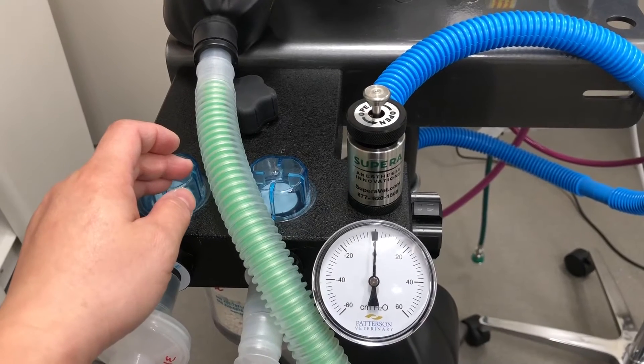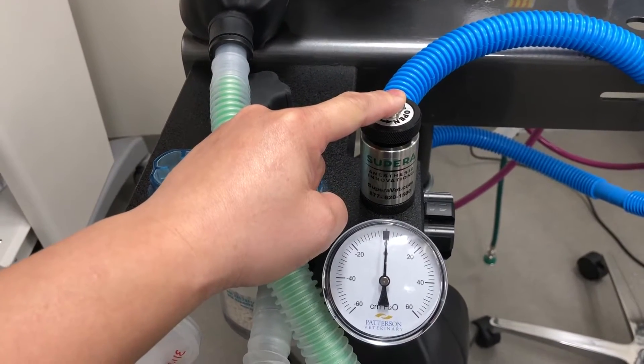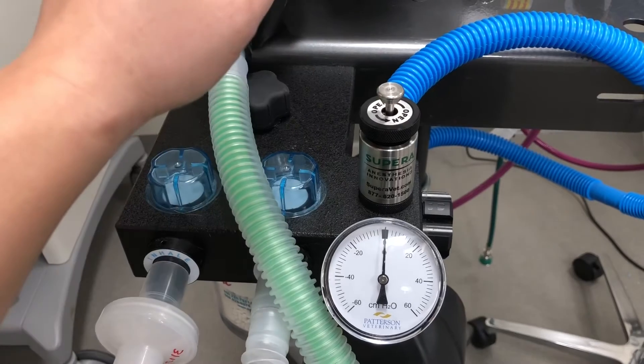When you're giving your patient a breath, what you want to do is just hold that button down, give a breath like you normally would, and then release the valve.